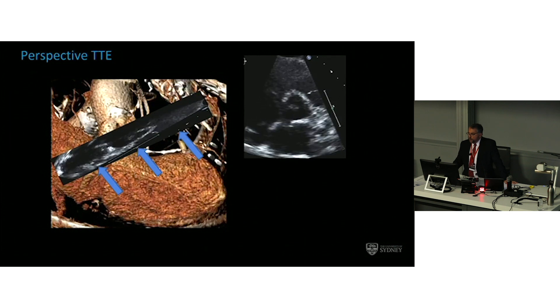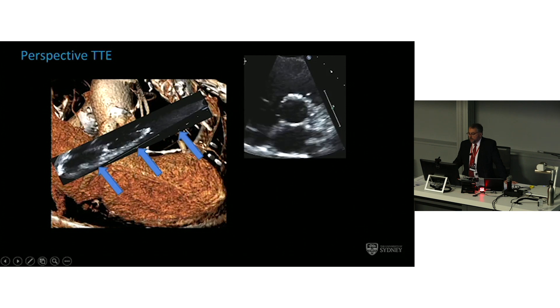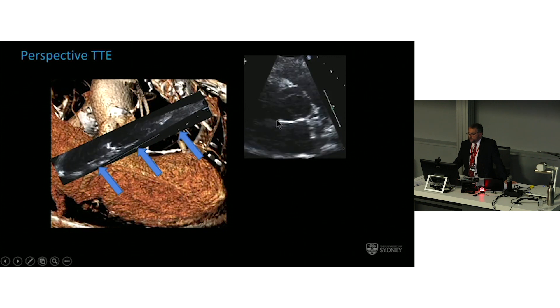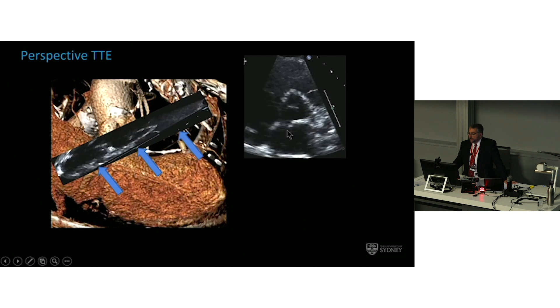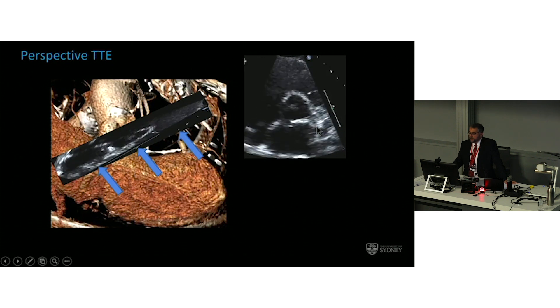In all of transthoracic echo, you're looking from below. Looking at this picture — a typical parasternal short axis — you're standing at the feet or at the apex and looking up. Think about your landmarks: there's the atrial septum, so by definition this is the non-coronary cusp. The most anterior one is always the right coronary cusp, and there's the left atrial appendage — therefore that is the left coronary cusp.